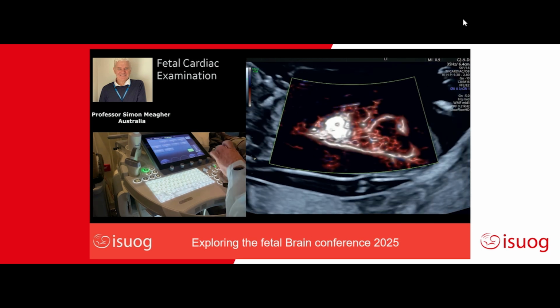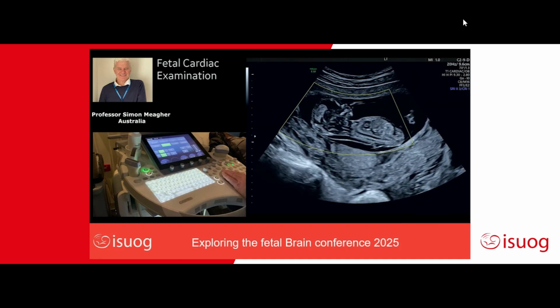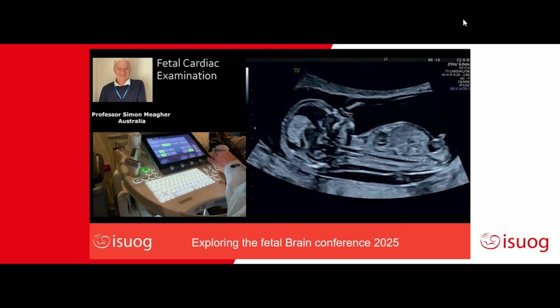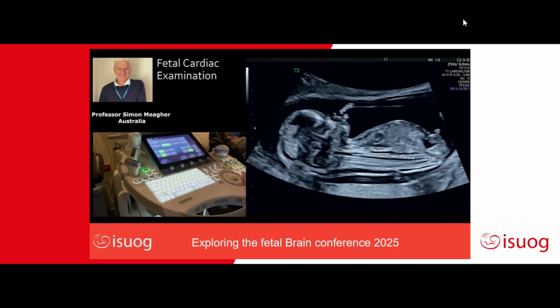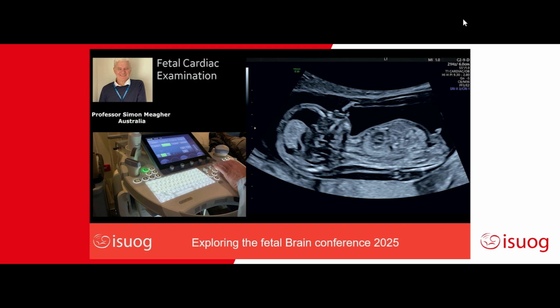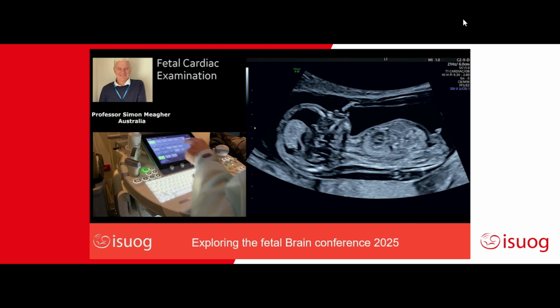And I'll finish up by just coming out of that for a second and looking at the aorta, which is important in the setting of seeing the nuchal that's at the upper limit. So let's just measure the nuchal translucency. We've got it perpendicular to the beam, correct magnification, defining the two lines, and then taking a measurement, going to biometry, second trimester, nuchal translucency, and then just take this measurement and see what we've got. Okay, that's coming down as just 2.5 millimeters at 13 weeks.